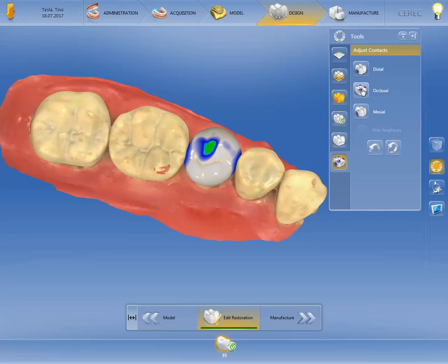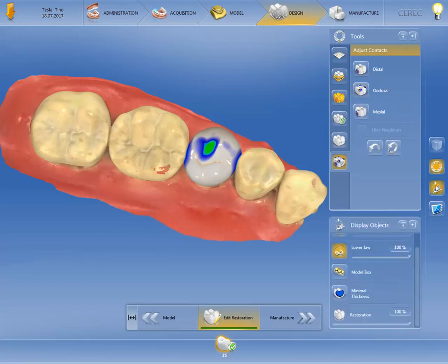In the Page palette, we now open the window for displaying objects, rotate the 3D preview, and adjust the visibility of the lower jaw so that we can evaluate the Approximal Contacts more effectively.